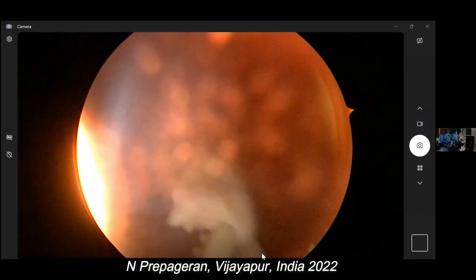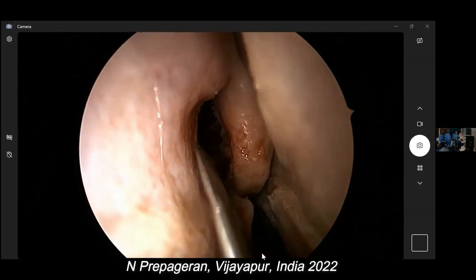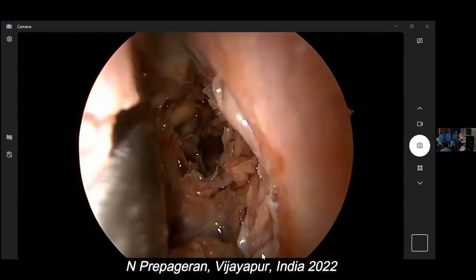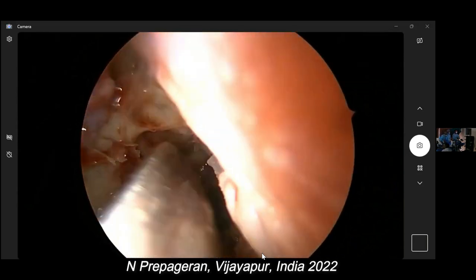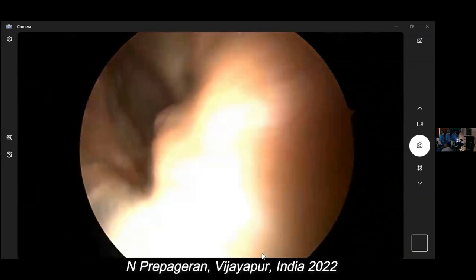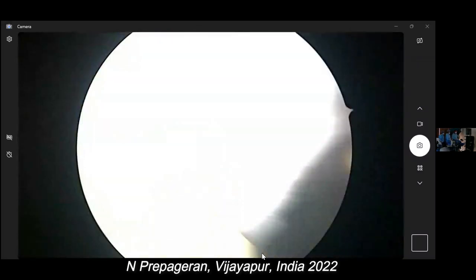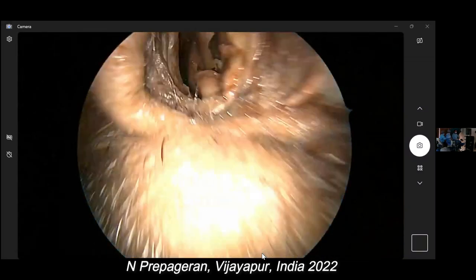So now that we have got... Please elevate again. There. So this is periorbita. Anterior ethmoidal artery. It's not clear. Let me just clean it one more time. Yeah. Tell me if it's not clear and tell me if you need anything you want to clarify before I move on.